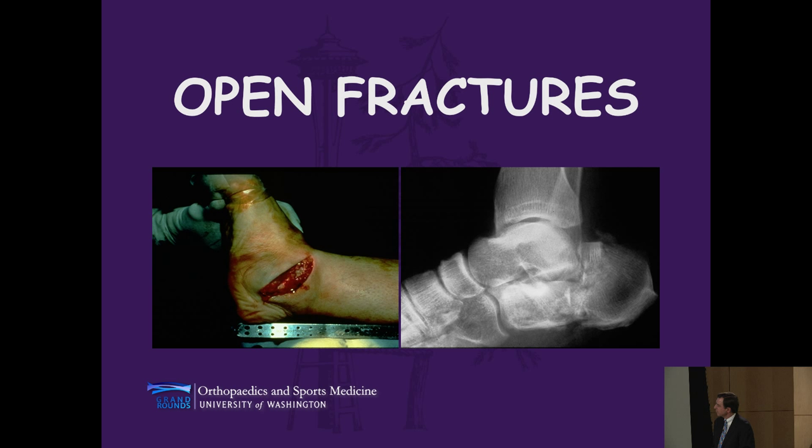Open fractures have always been a bugaboo with respect to management because of the concern of infection. Since most of these injuries are medially open wounds, we've identified that perhaps there's a better way of managing them than when we originally performed the surgery, because we didn't adequately reestablish the shape of the bone and tried to manage the medial wound just with dressing changes. And you can see the substantial displacement of this particular injury.